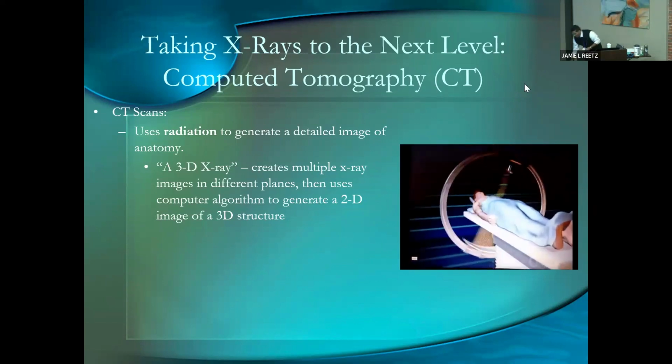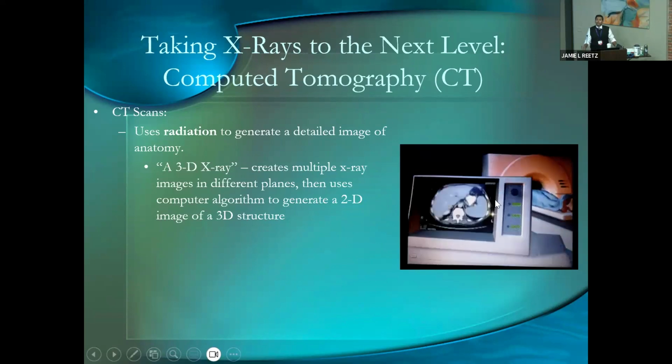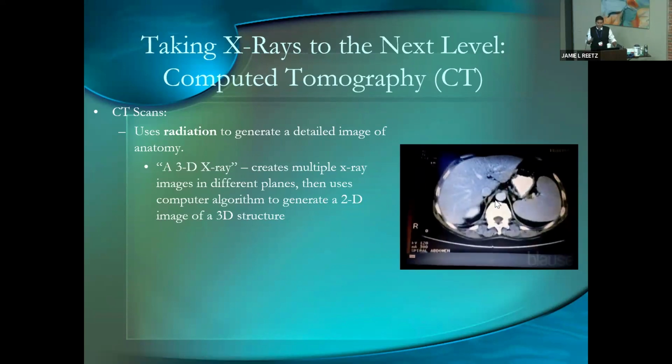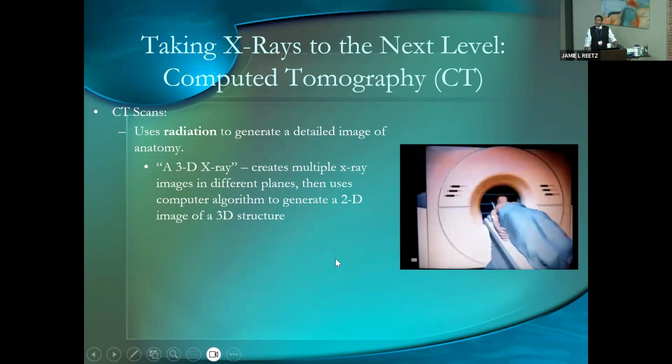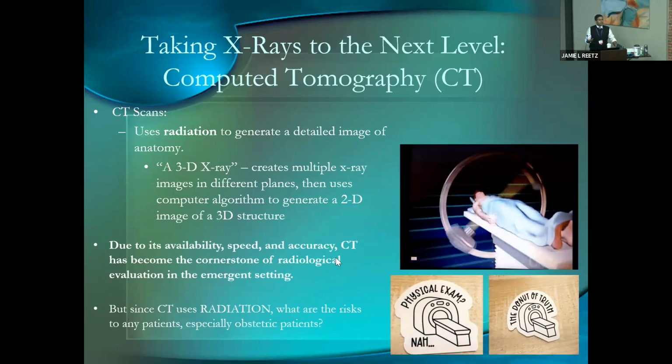You can see on the graphic here that's exactly what's occurring: the patient goes to the detector. The spinny thing out there is the X-ray. It's basically taking millions of X-rays at multiple angles and summing up that information for us. So when you think of CT, all you have to think about is fancy 3D X-ray. And really, it's the cornerstone of medical imaging.